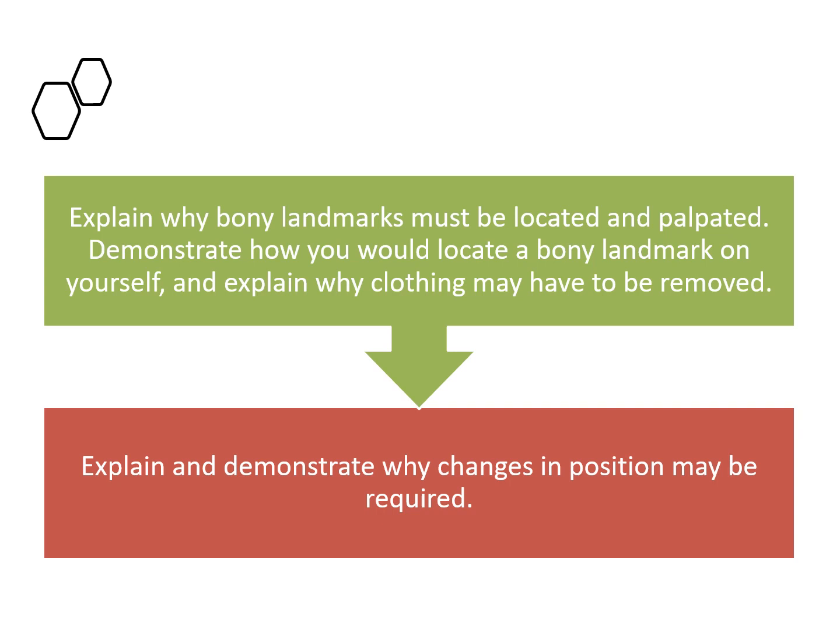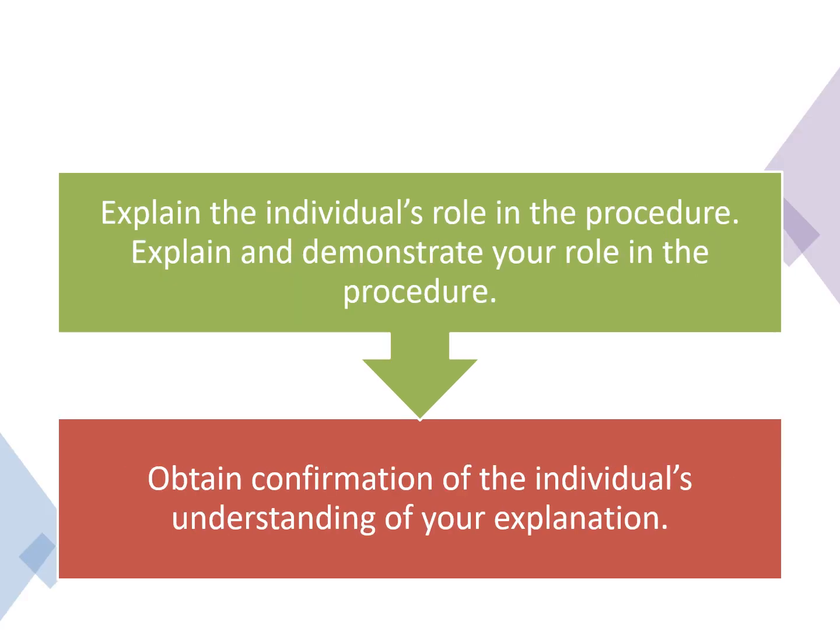First, explain the entire procedure, that you may require to change the patient's position because so and so range of motion you have to take, and it is important to maintain the patient in a particular position only. If you deviate from that particular position, the range of motion will not be correct anymore. So beforehand only, when you meet the patient, you need to explain all these things verbally to the patient. Once he has understood, the patient will very well cooperate with you and you will end up having accurate and reliable recordings. So these are the points which you must remember.